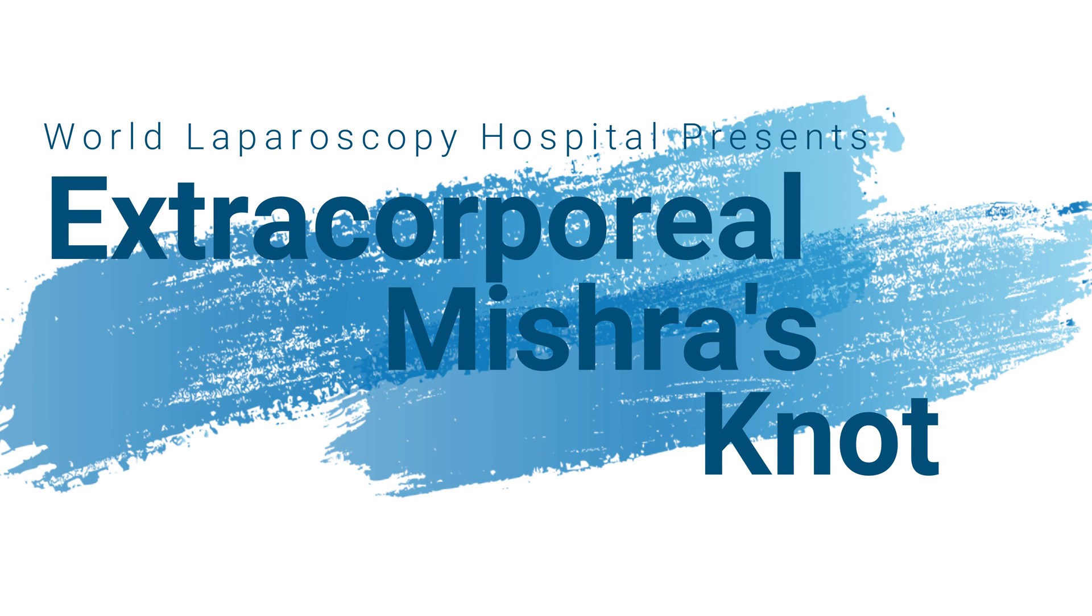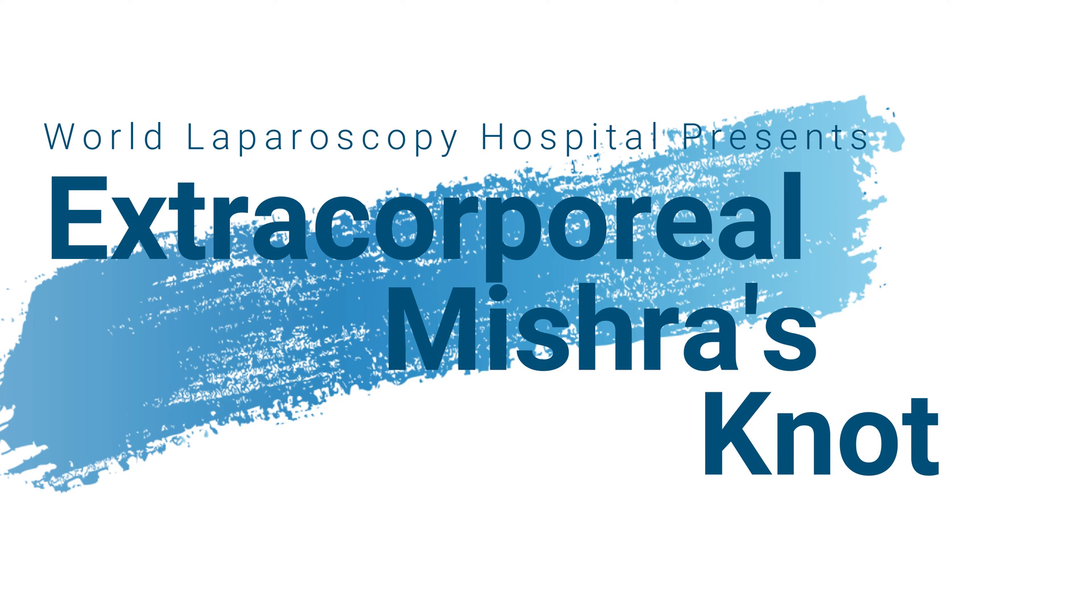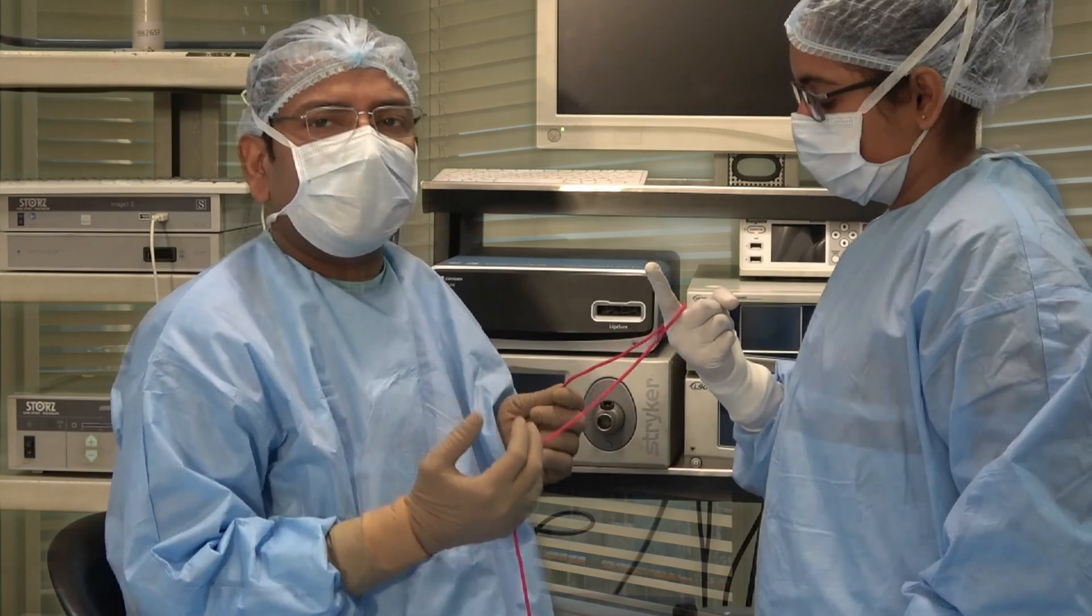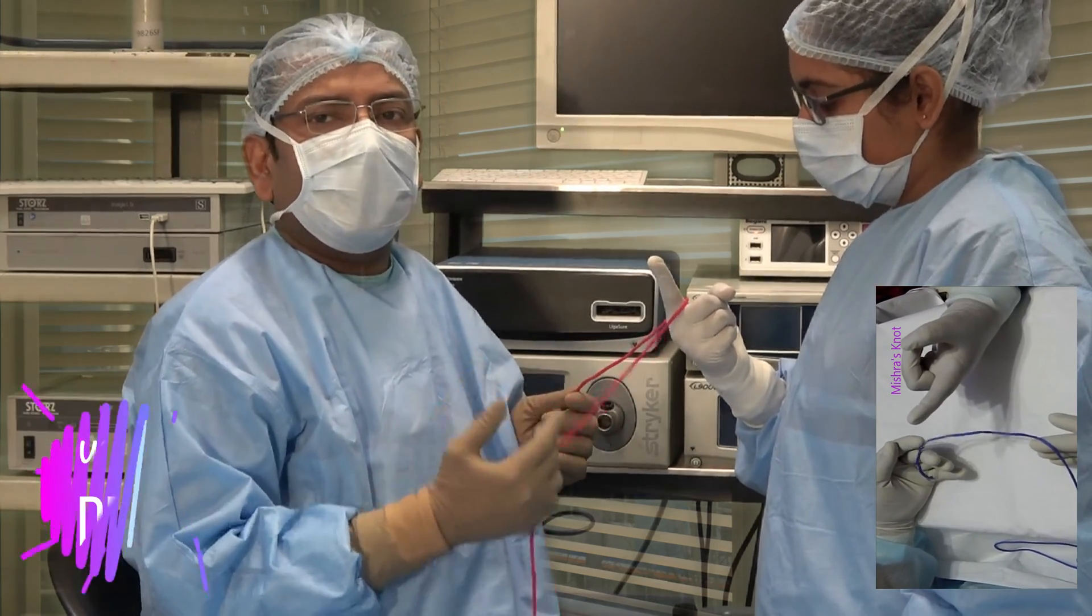Hello friends, today we are going to discuss the extracorporeal Misra's knot. This is a very good knot for tubular structures up to 18 millimeters in diameter.